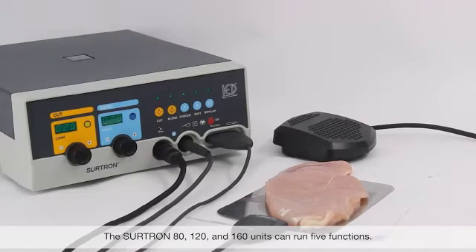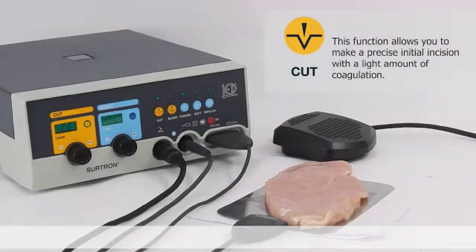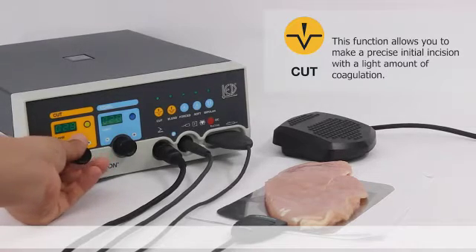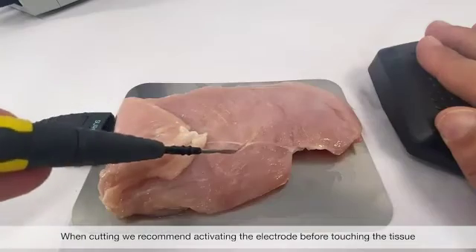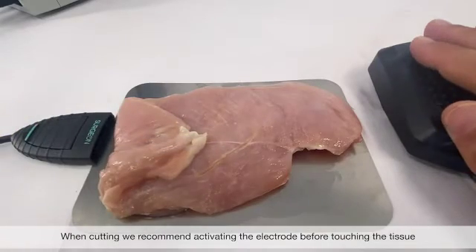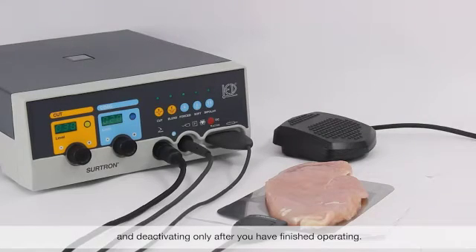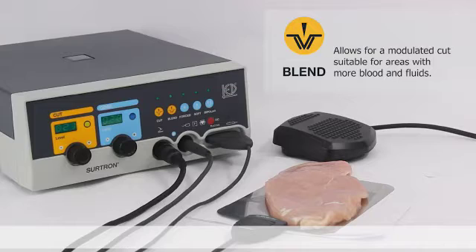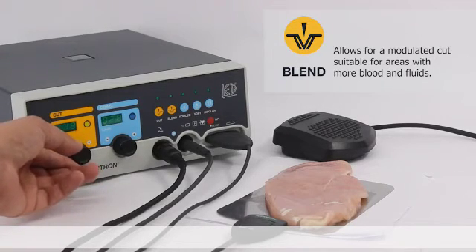The Surtron 80, 120, and 160 can run five functions. Pure cut: this function allows you to make precise initial incisions with a light amount of coagulation. When cutting, we recommend activating the electrode before touching the tissue, and deactivating only after you've finished operating. Blend cut: this function is modulated and provides a bit more coagulation, suitable for areas with more blood and fluids.